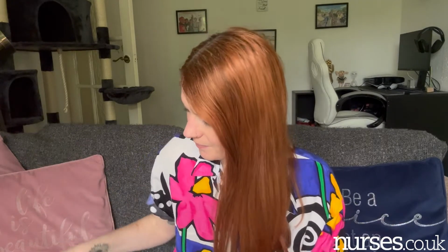The first two that I'm going to go through is blood pressure. I have a manual blood pressure machine because I find it easy to use. It's what I've always used, it's what I trained on, and I just love a manual blood pressure. I trust my own ears rather than a machine that could potentially go faulty, or batteries might die. It's really good to get used to having a manual set, especially if you're out in clinic and your machine dies on you. You're going to want to know how to use this.